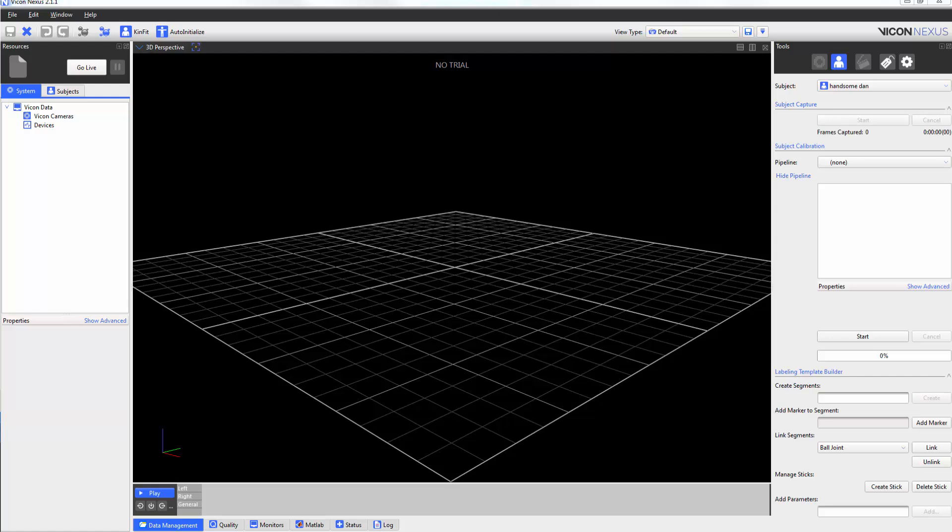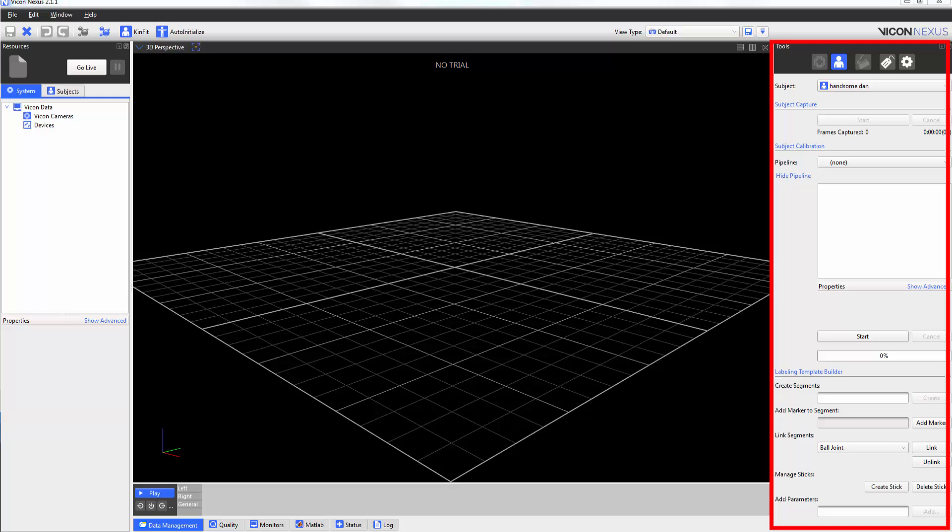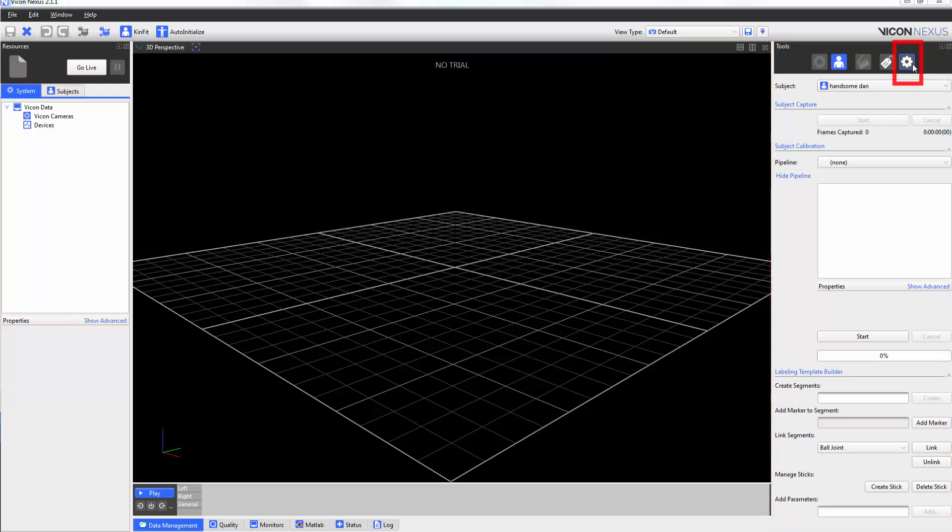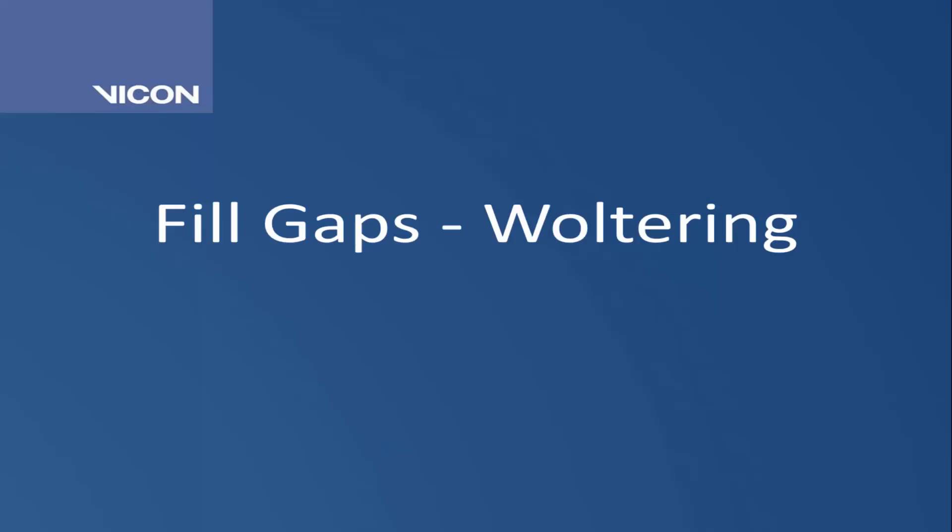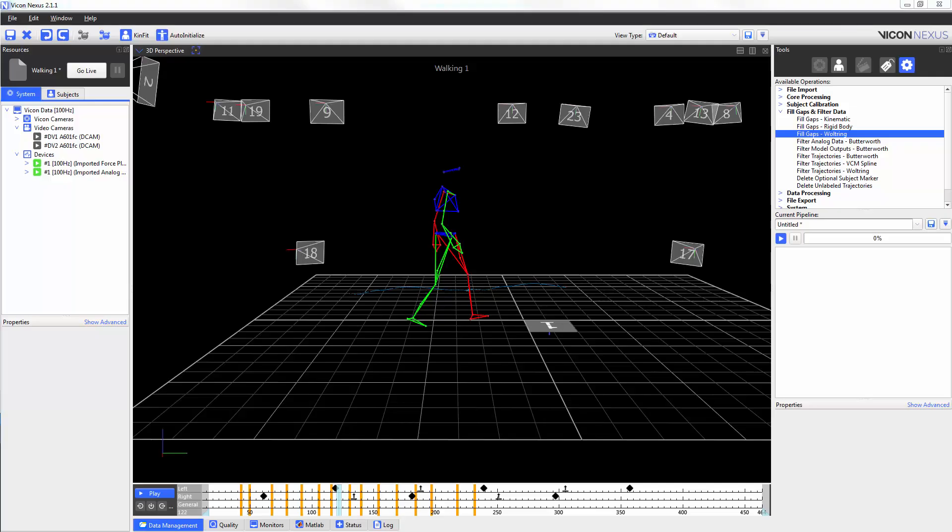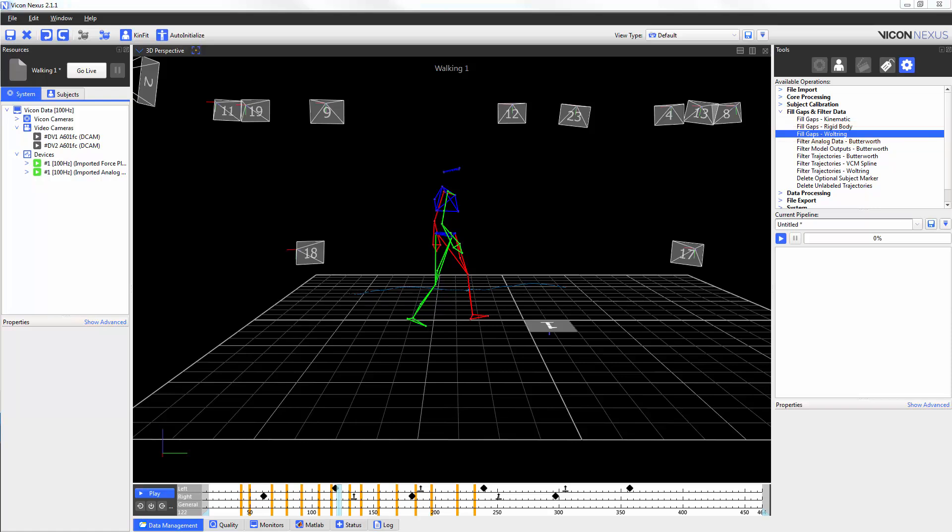You can find the fill gaps and filter data heading underneath the tools pane here on the right hand side of my screen, navigating to the pipeline tab and you can see the heading over here. The fill gaps Woltring pipeline operation fills trajectory gaps by using a Woltring quintic spline and this is best used to fill small gaps.